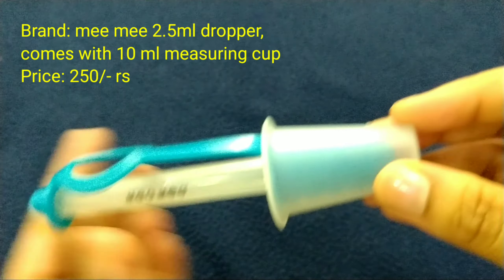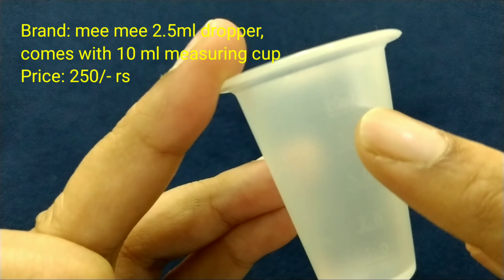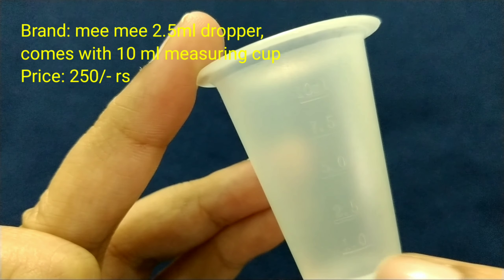The next is Mee Mee medicine dropper. This is a 2.5 ml dropper. I am going to show you how to measure 10 ml. The price is Rs. 250.